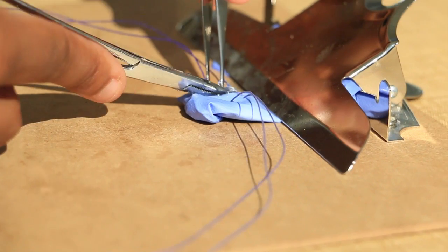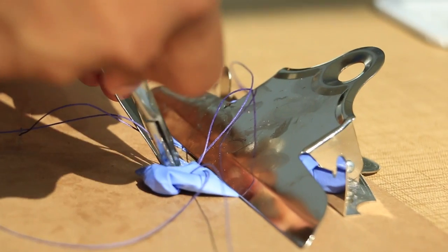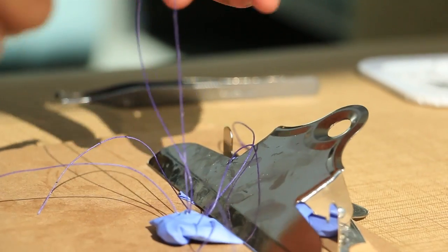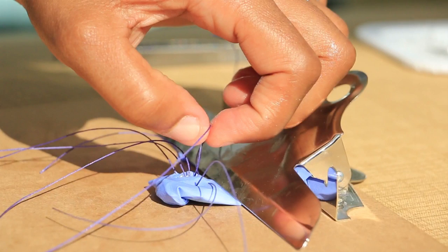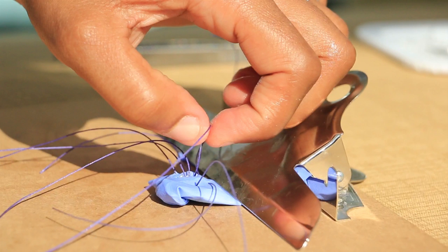At this point, the previous sutures are visible running through the cyst. These are elevated with a Kelly clamp so that there is additional slack in the middle of each stitch. This middle is then incised. The result is a series of individual interrupted sutures which have, by definition, gone through both skin and into the cyst wall. These are then individually tied down and marsupialization is complete.